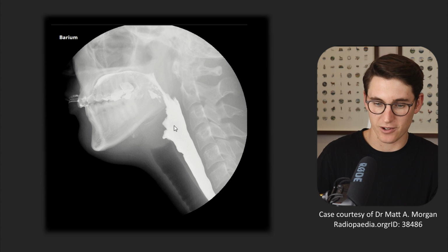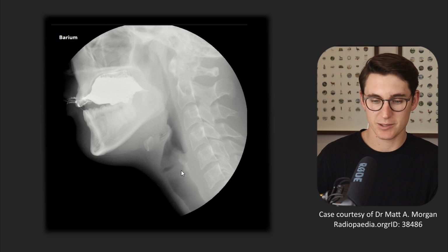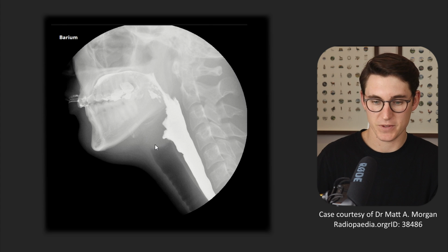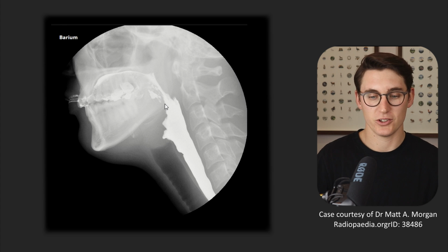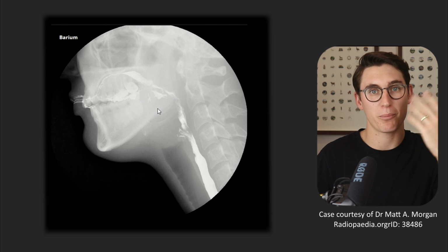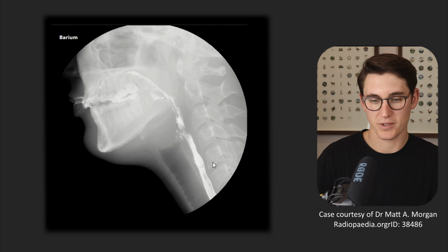And this fluid now is having to track posteriorly into our esophagus. None of that fluid is coming into the larynx. Similarly, you can see our vocal cords here lifting up, up, and shutting. So we completely shut that trachea off from our digestive tract. You can also see how the soft palate rests against that posterior pharynx, which prevents fluid from coming up through our nose as well. And then we can follow that liquid all the way down.